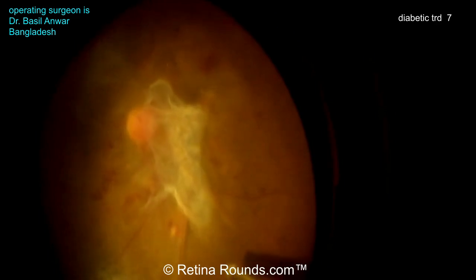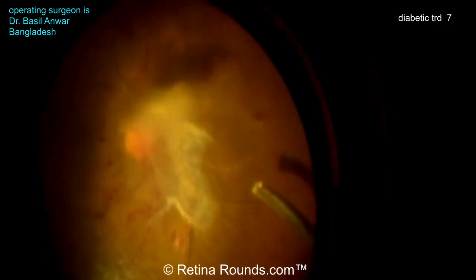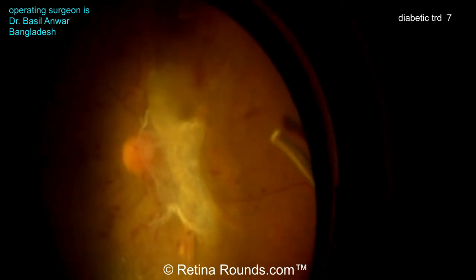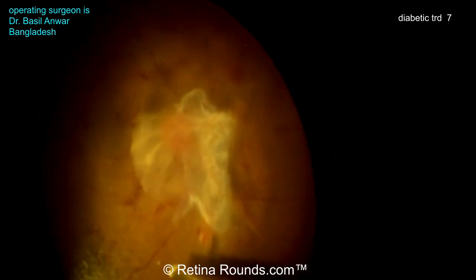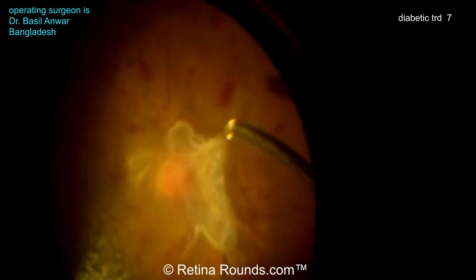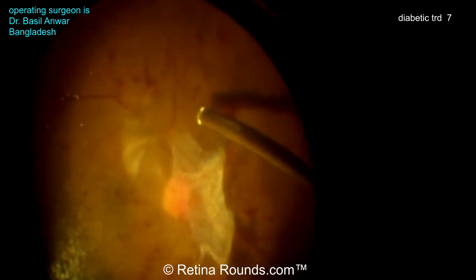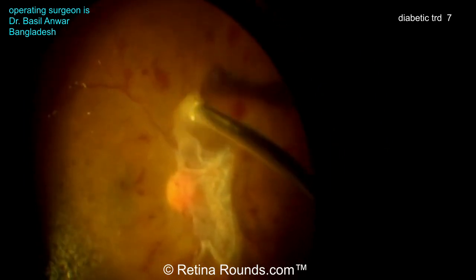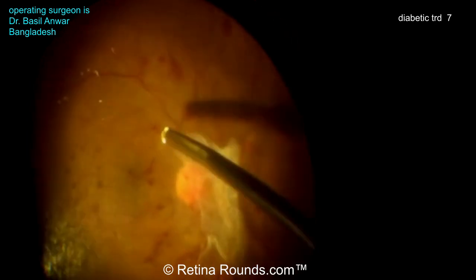Now he's tackling this membrane posteriorly and doing another very important step, which is to segment the membrane 360 degrees. There are vitreous adhesions all the way around this membrane, and some of them can even be glued down to the adjacent retina. So by going around 360 degrees and elevating the vitreous, he's going to create space so that he can get under that membrane and dissect it off the surface of the retina.